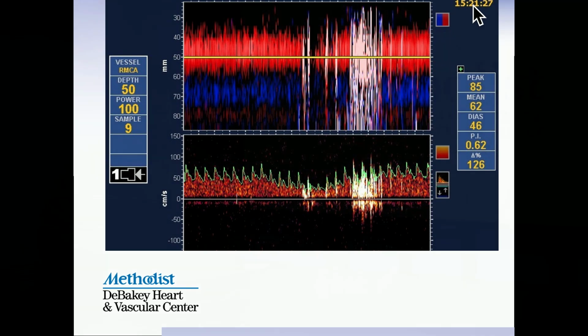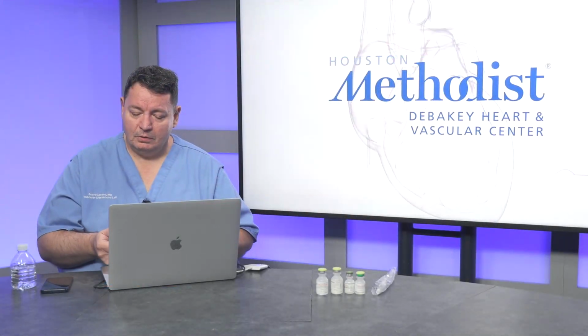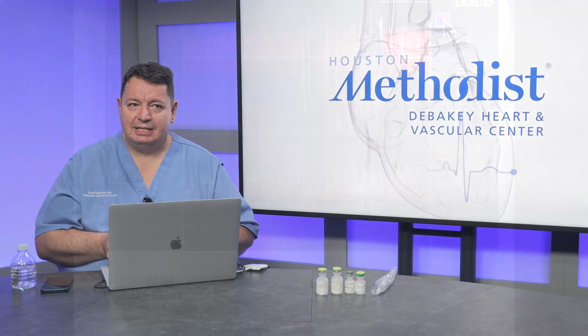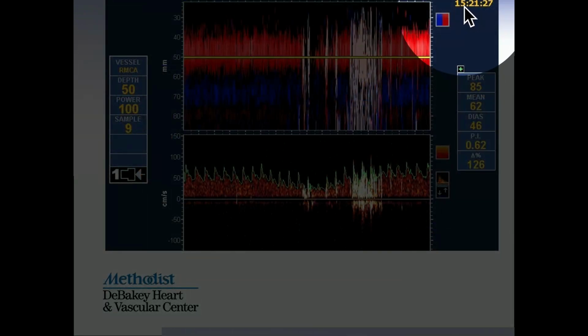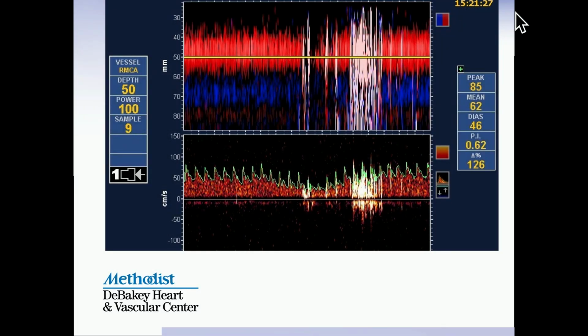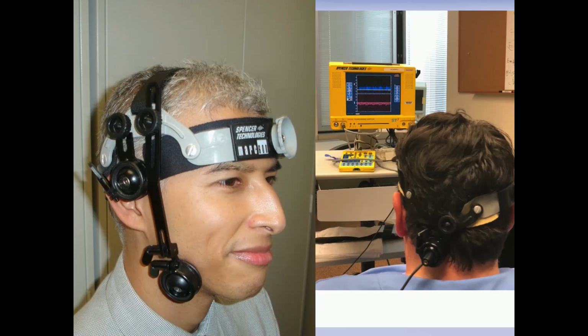Another very important, just a personal and really useful practical trick is your time. When you're injecting, you're watching the TCD time and you're injecting at 0,0. When the seconds are at 0,0, it's really easy to count up to 30 seconds, which is the total emboli count, to give you the 30-second total count of your embolization. So this is where, again, the total emboli count comes in.